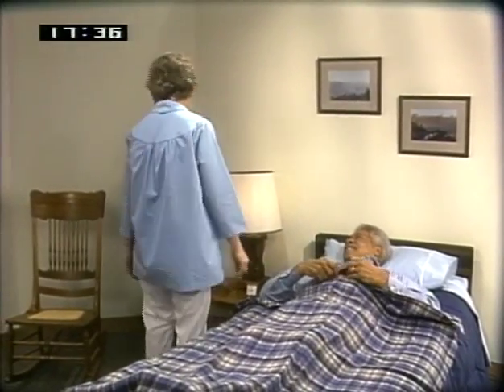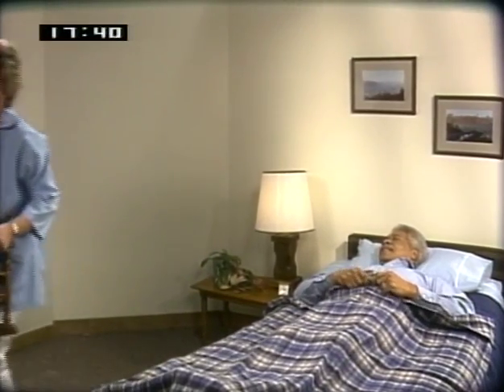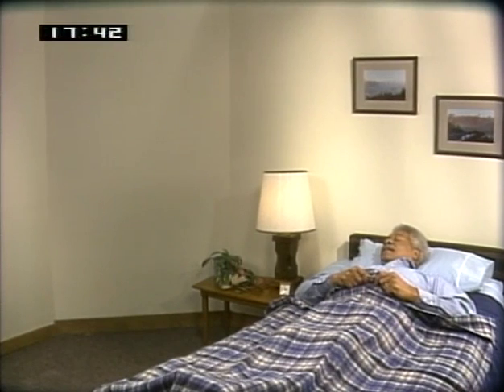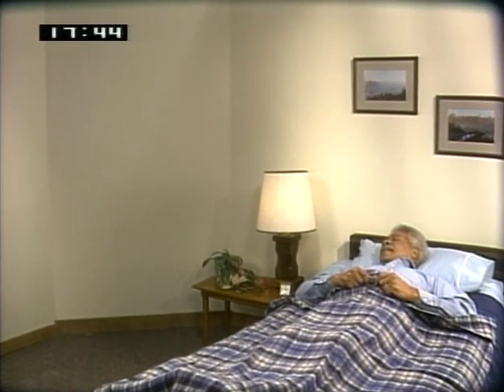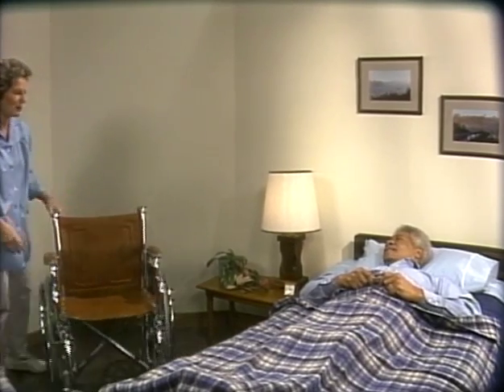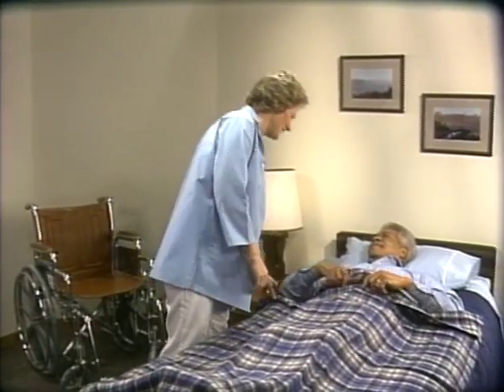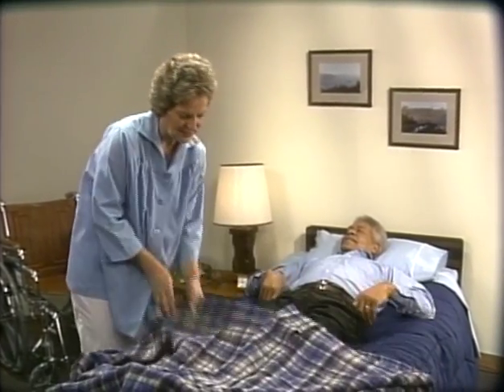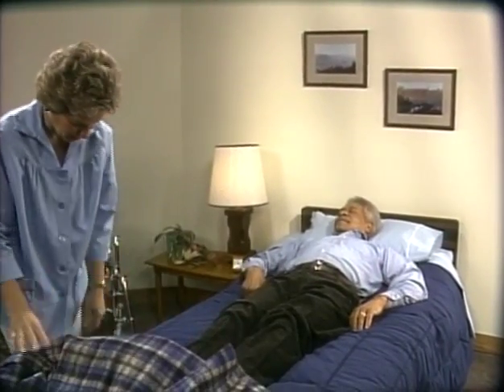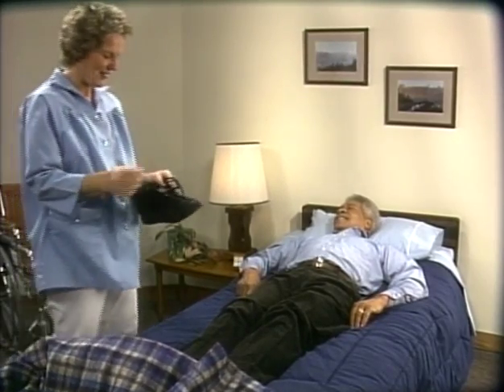Let's observe the transfer of Tom into the wheelchair. Be sure that there is enough room available to perform the transfer procedure. You may need to move some furniture out of the way. Explain the procedure to your patient. Fan fold the bed covers to the foot of the bed. Remove pillows to allow free movement. Your patient should wear shoes or slippers with gripper soles so they will not slip when transferring.